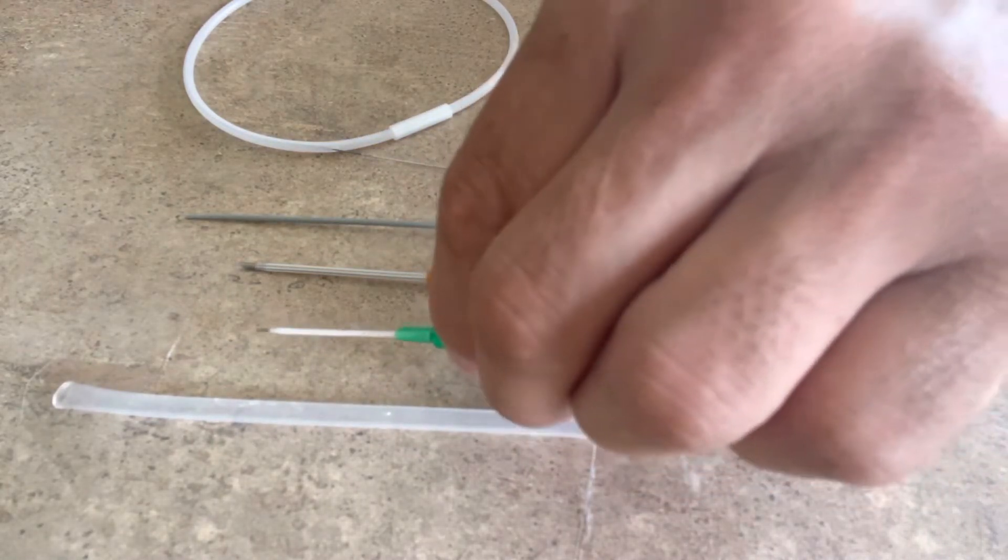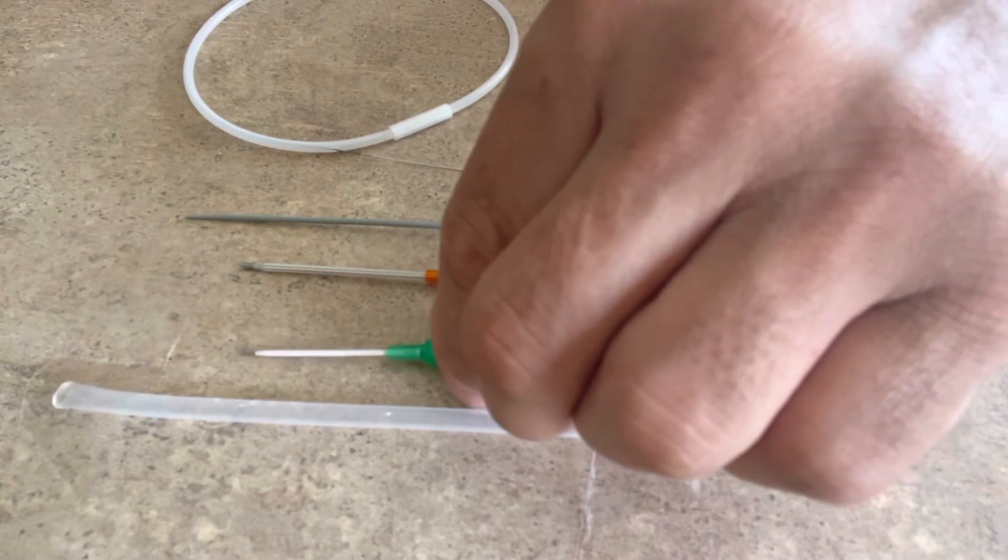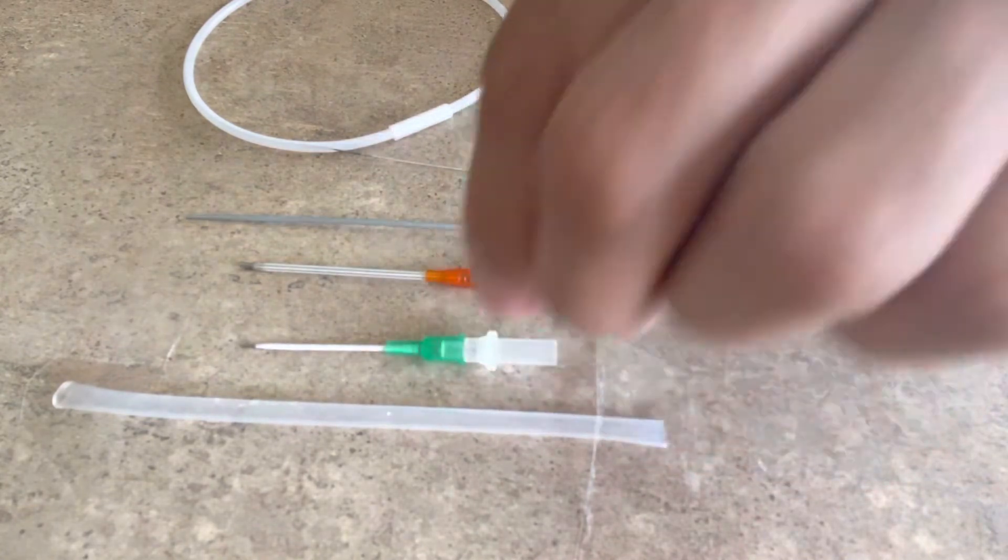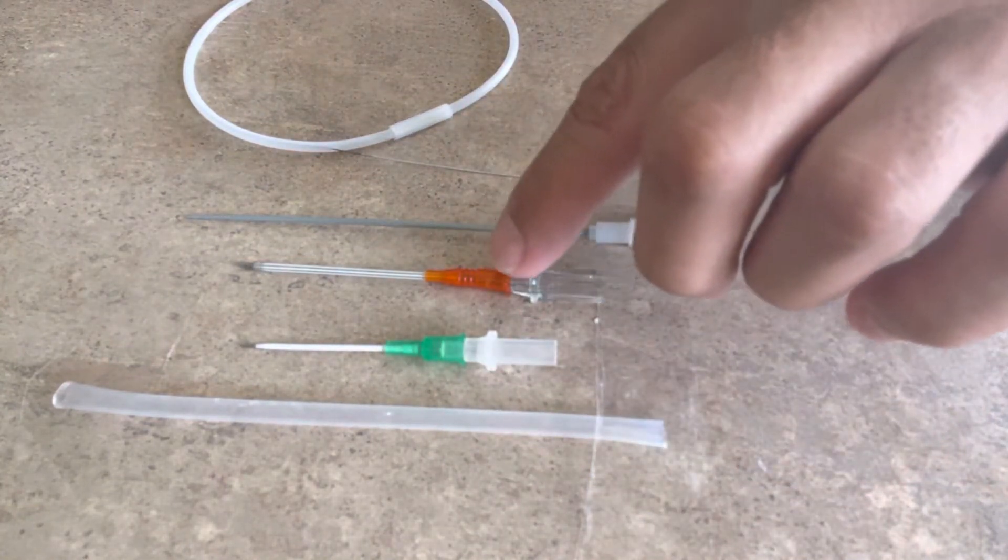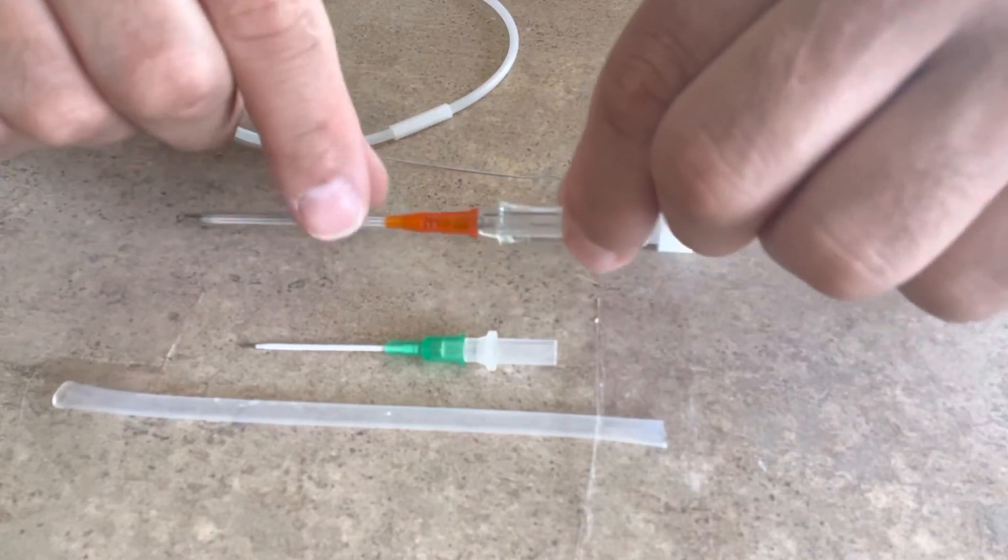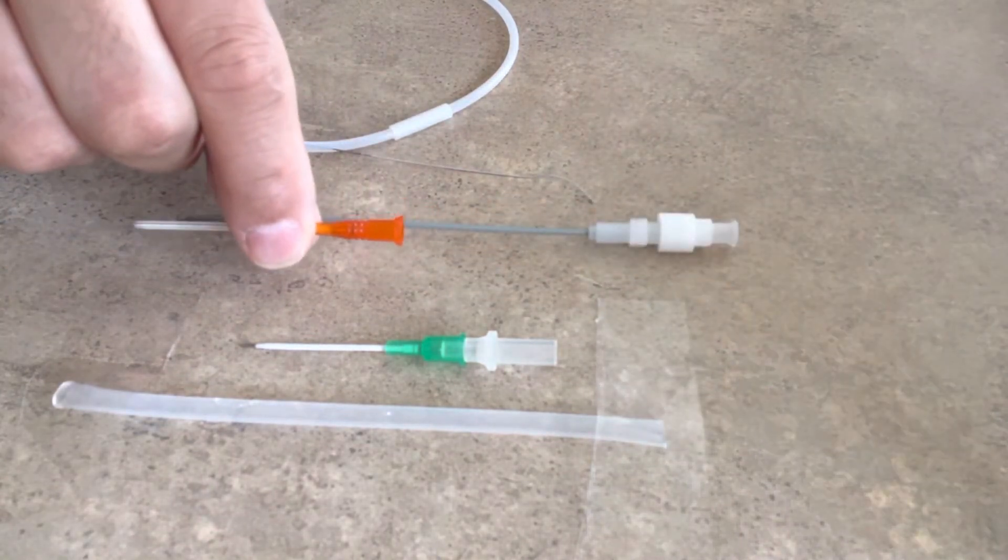And so before I start, things that you want to do is you want to make sure that you load your 14 gauge angiocatheter onto your micropuncture dilator.